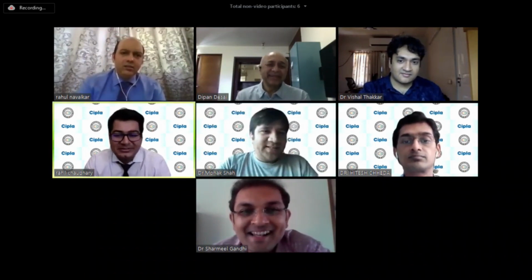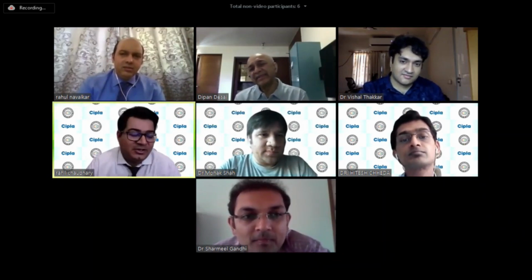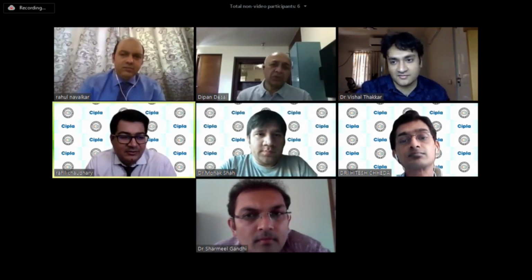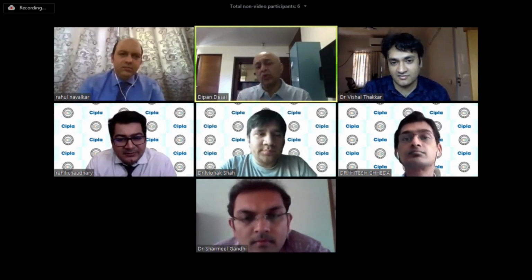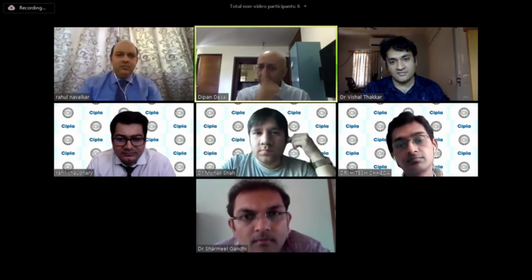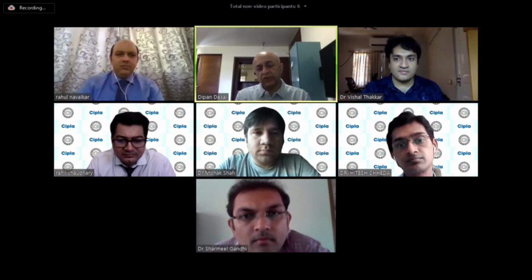One very basic question to the panelists: how do we assess that the IOL is rotated post-op? Yeah, very, very basic, just for the audience's sake. What I do is, as a rule, on the first post-operative day for all my toric lenses, I dilate. First post-operative day, and on the 7th. So that is one thing that is very essential.